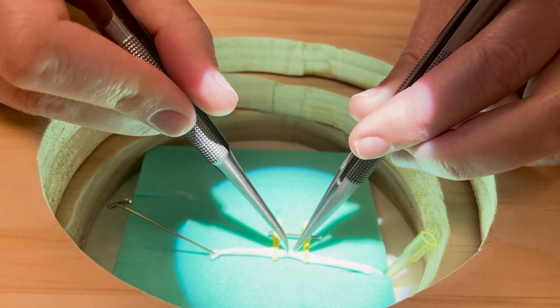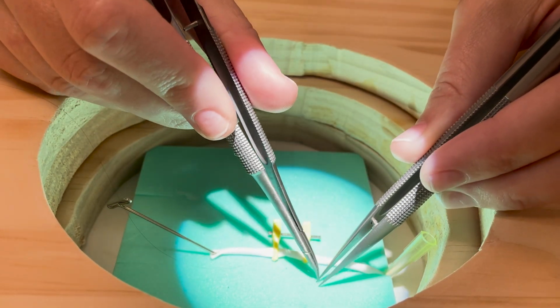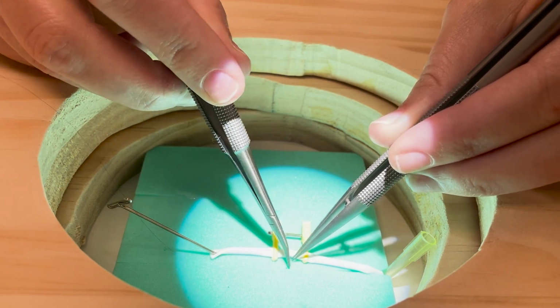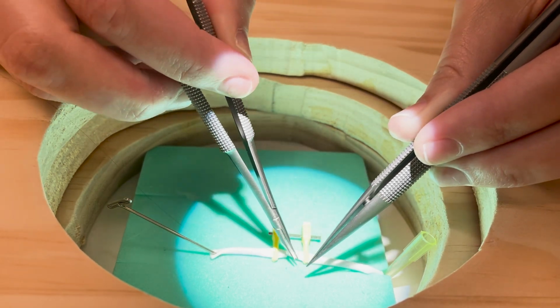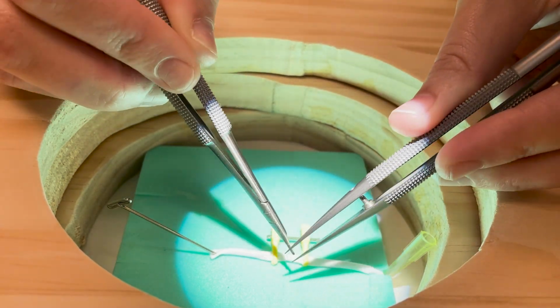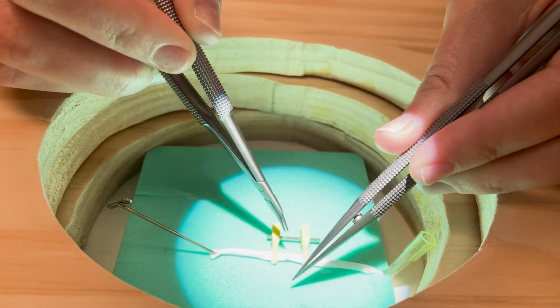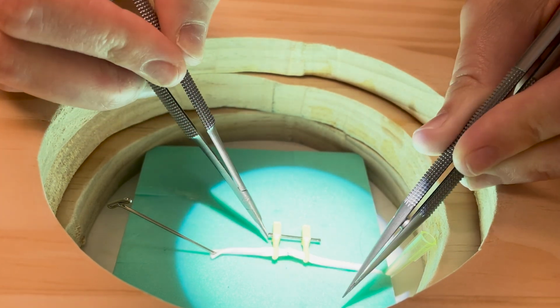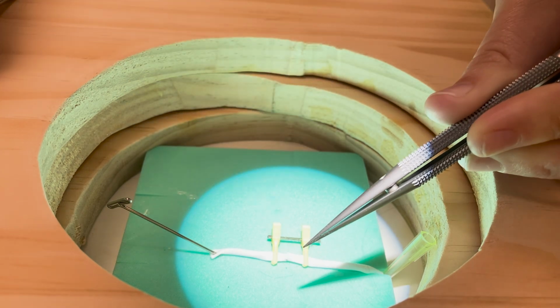The goals for Task 5 are to maintain competence in previously gained skills while performing an anastomosis within a depth block. The previously mastered skills are suture handling, knot tying, double Acland clamp placement, bisecting suture placement at 180 degrees, even suture placement along front and back wall, full thickness bites, and no back wall suture placement.